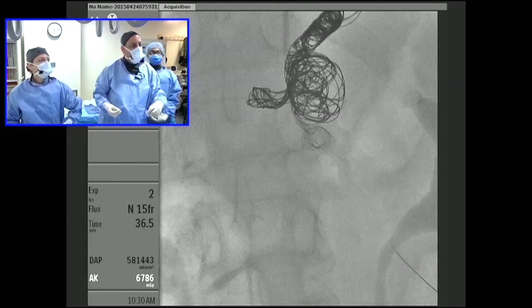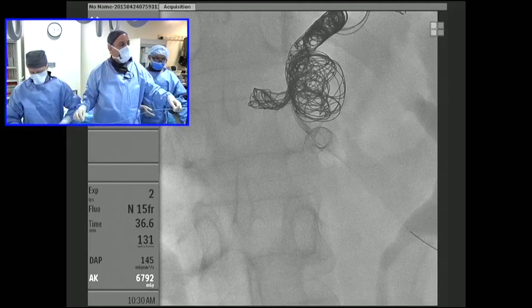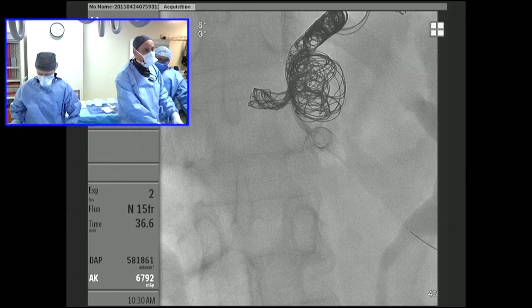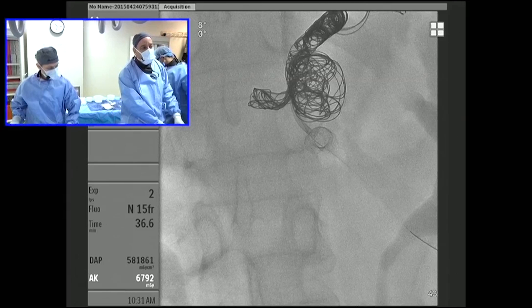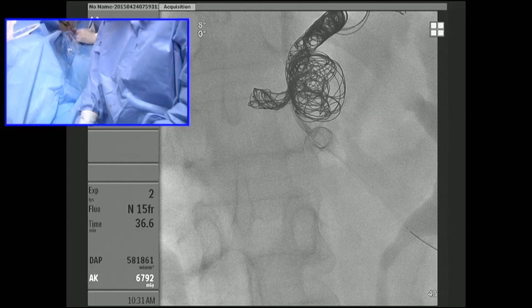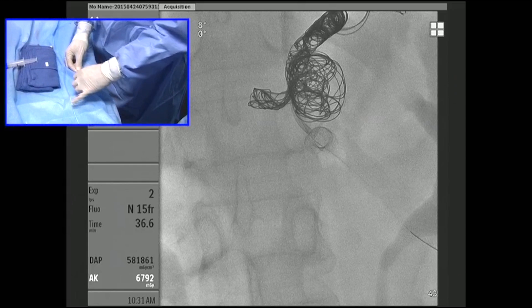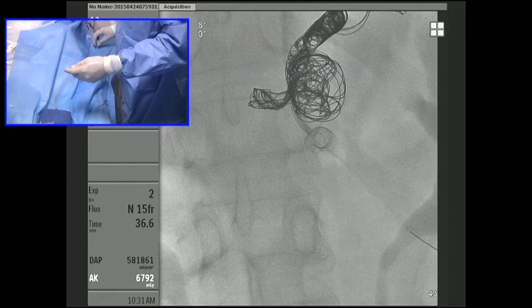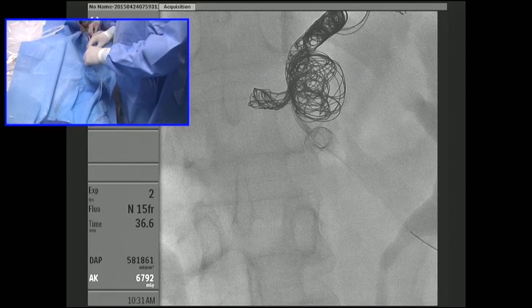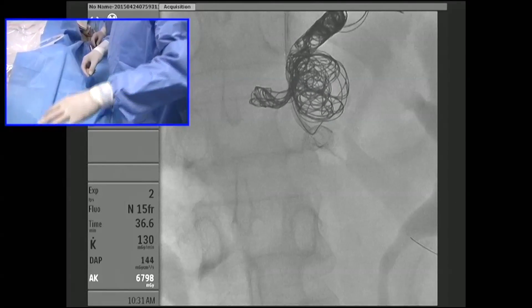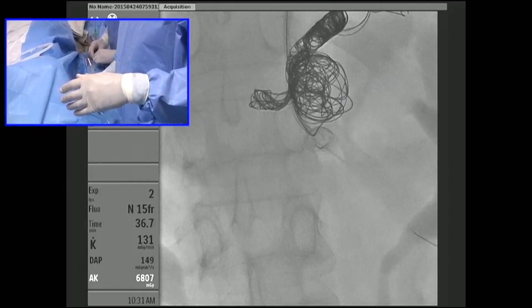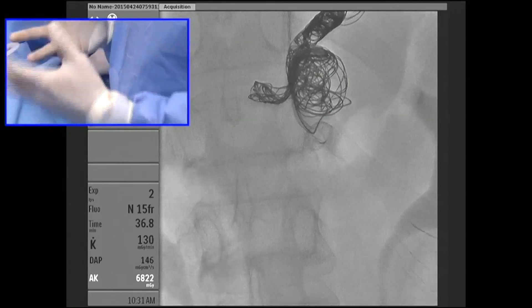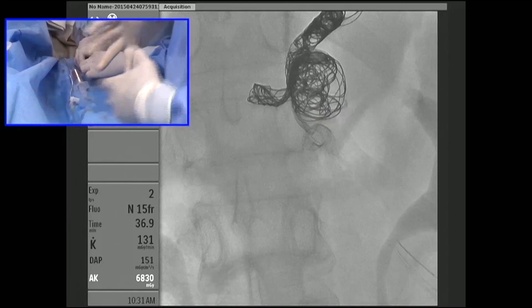We've put in a handful of coils already into the celiac artery and are starting to get a really nice nest here. We're going to put in another one of the interlock coils — this is the interlock system from Boston Scientific, which is a great coil. All these detachable coils are fantastic technology. Nora is introducing the coil into the aneurysm sac; this is a very large coil, at least 20 millimeters in diameter or probably 50 centimeters in length, and it's just going to fill up a tremendous amount of space.